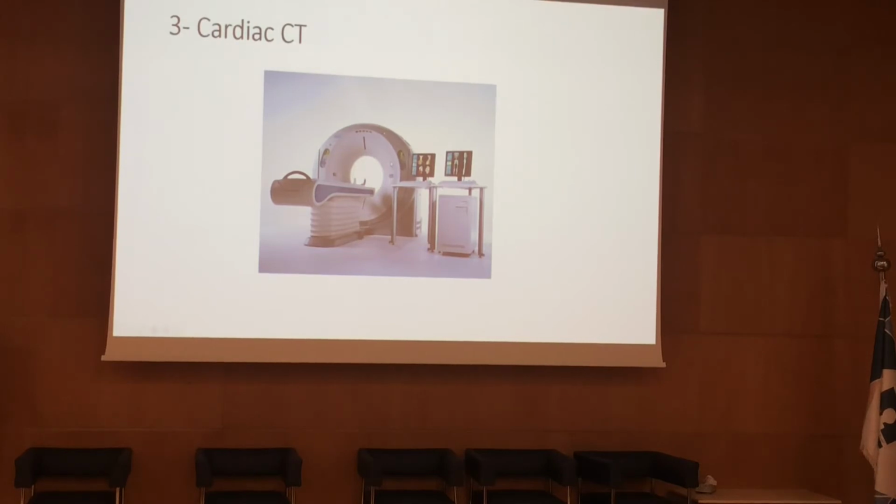And actually, how do we do the CT? We put the patient on the table, and we connect him with a cannula to give him contrast. Most patients going for a cardiac study get a small amount of iodinated contrast. This table will move. This is the gantry. The source of radiation comes from here. There are dual sources, meaning two radiation sources come to the patient to minimize time inside the CT scan.